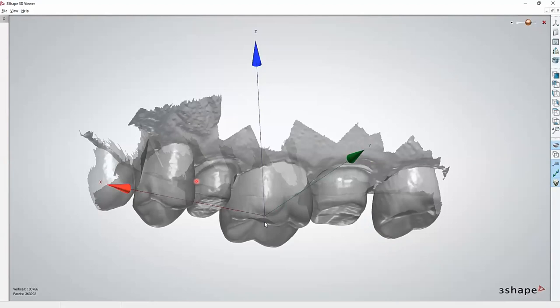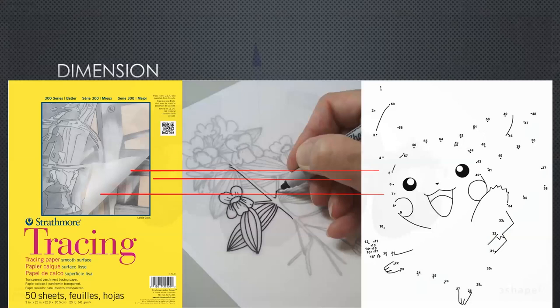So the software interprets this data and goes through slice by slice, and it figures out what each of these coordinates are. Exactly like our friend Pikachu over here, whose left ear consists of numbers 44 through 53, the software will slice through each of those layers of a 3D object and tell our printer where it should be connecting and where those dots are tracing. And this software is quite conveniently called a slicer.